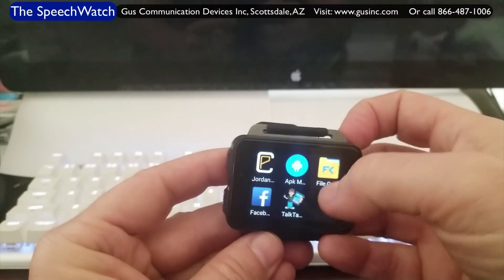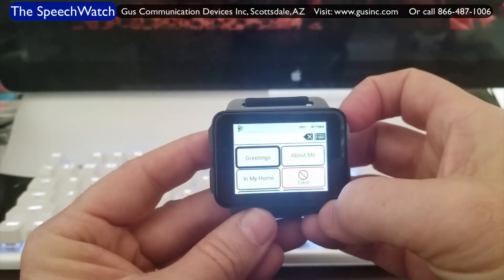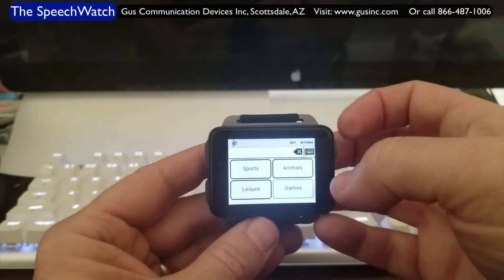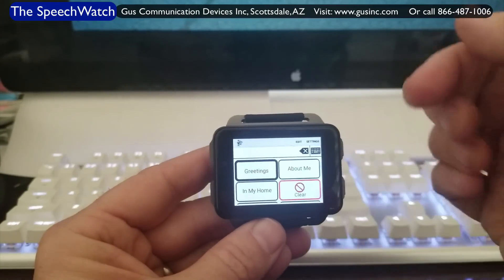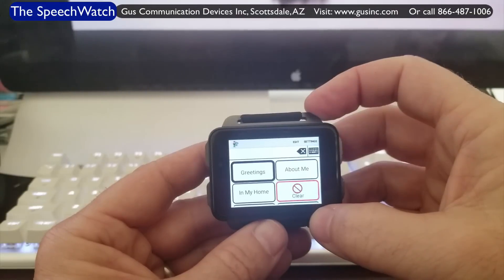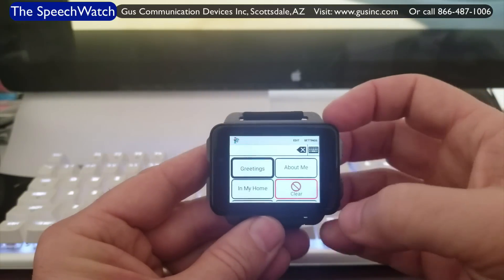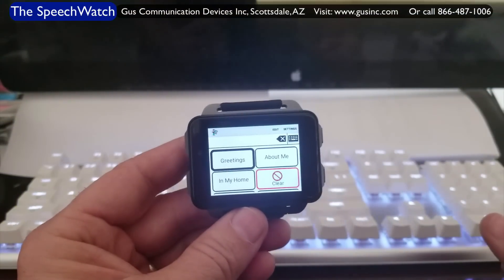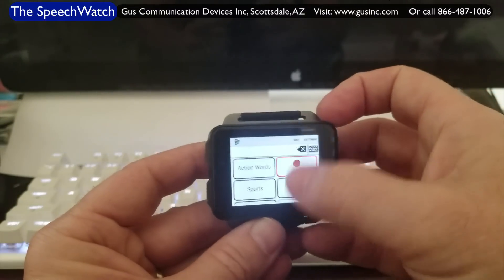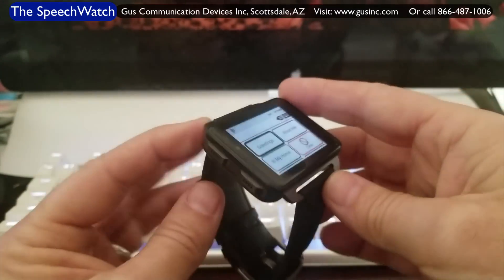Most importantly, I have TalkTablet installed. So let's start up TalkTablet. I can show TalkTablet with or without symbols. There's a message bar across the top, a backspace, and a keyboard button — exactly the same as the Android version of TalkTablet. This is the TalkTablet Pro app running on the speech watch. We pre-install it before the watch goes out, and it actually takes a couple of hours to get these watches ready before they go out the door.